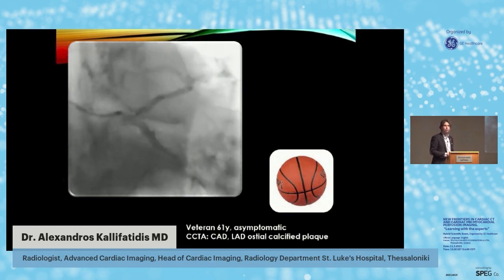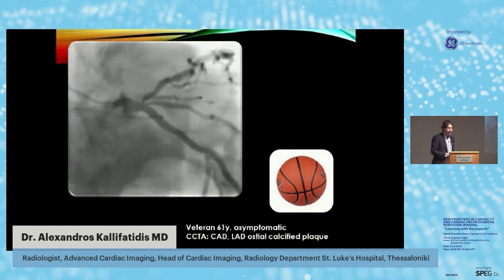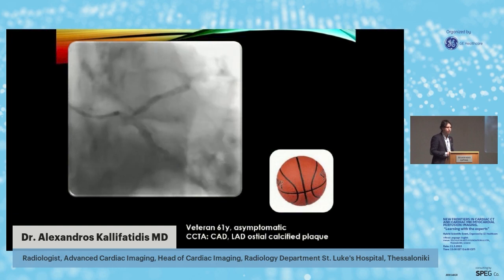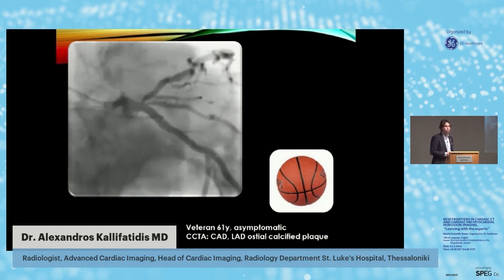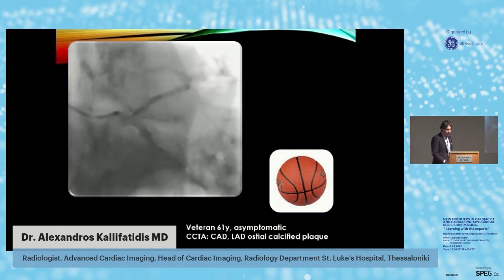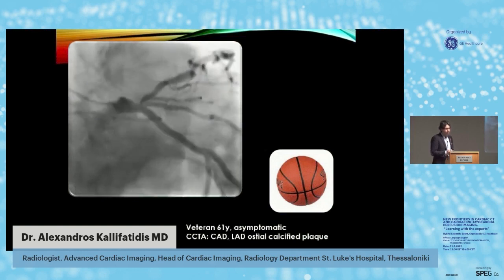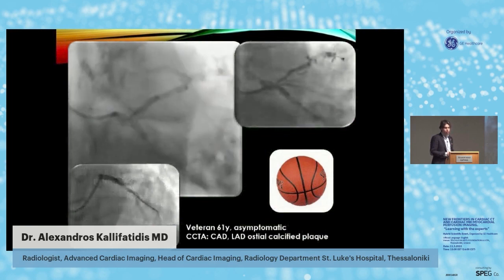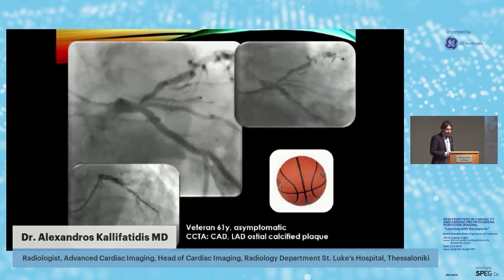Let's see another clinical case. It was about a veteran athlete, basketball player, asymptomatic, who had a coronary artery computed tomography as a screening that showed a probable severe stenosis in the ostium of LAD. So this patient was referred for further exploration to the cardiologist and the catheterization, and we can see this stenotic lesion in the ostium of LAD that was quite tricky, probably not so severe. The cardiologist wanted to be sure, and they proceeded with invasive FFR that showed normal values, more than 0.8, which is considered a normal FFR value.